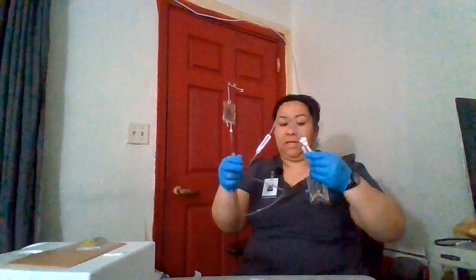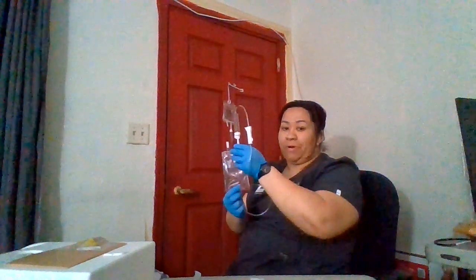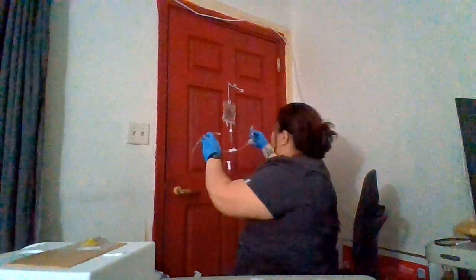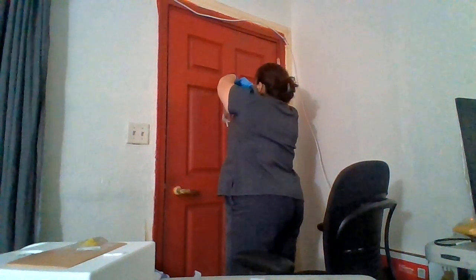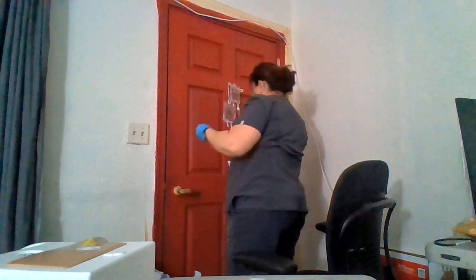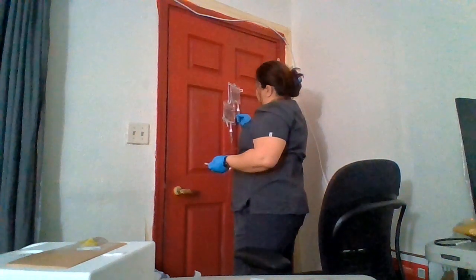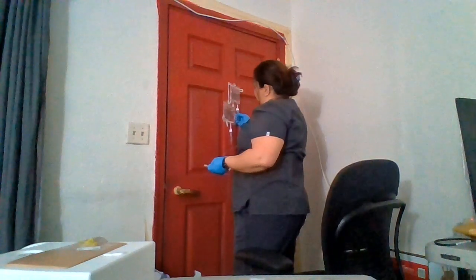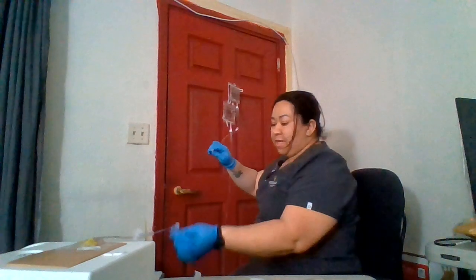We need to make sure that our roller clamp is closed, so it is in a closed position. I will be hanging this one a little bit higher than my primary. Next step is I will squeeze the drip chamber to get it at least halfway full. Okay.